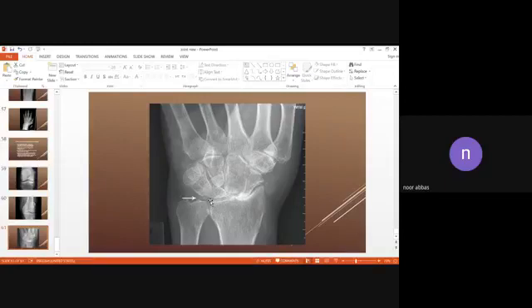The reason why it is called pseudogout is that it has a clinical presentation similar to gout, and it is also related to crystal deposition, but the radiological changes are somewhat different, the hallmark being the presence of calcification within the cartilage.